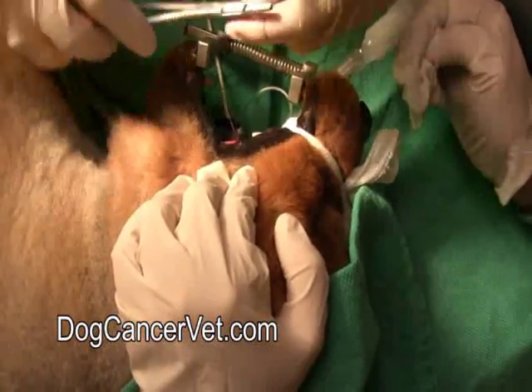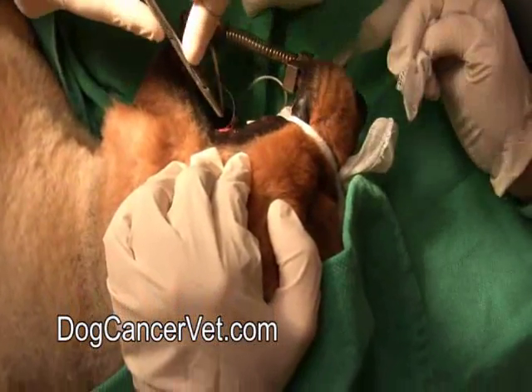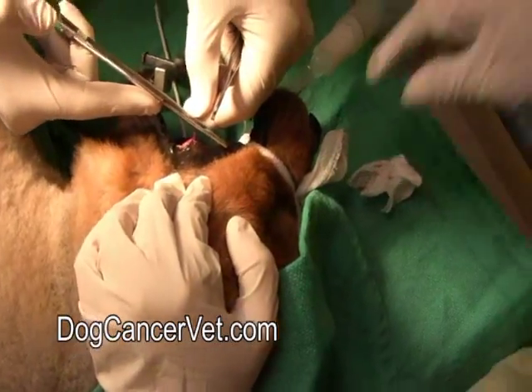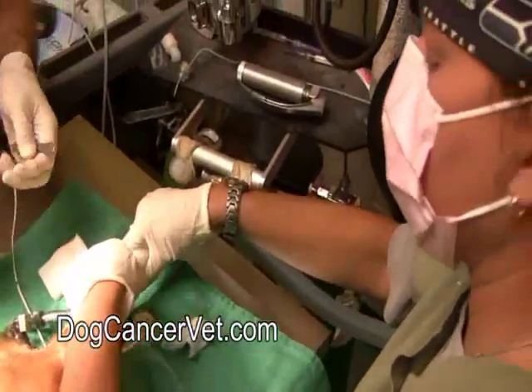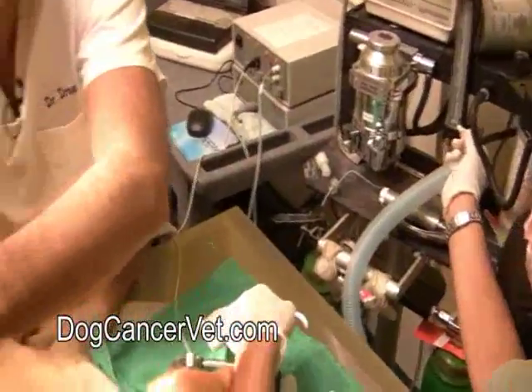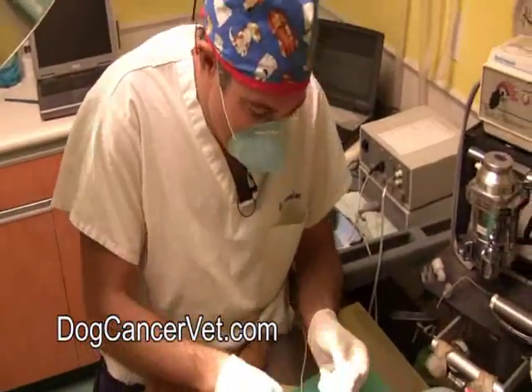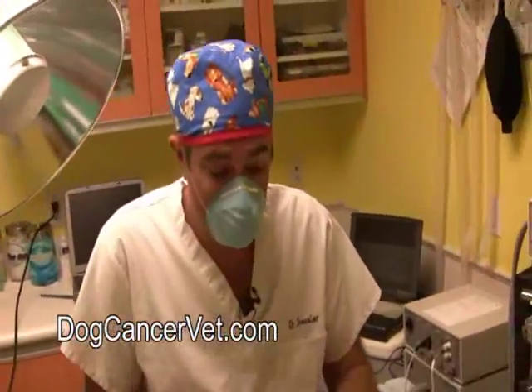Gas off. Okay, we're going to turn our isoflurane, which is the gas, off because we want to be waking this guy up now. Okay, we're done with the biopsy procedure. All that we're going to do now is just dab this off. He's already got his pain control medication on board, which I administered to him before the surgery, so he'll be comfortable when he wakes up. And that's how you do a biopsy.